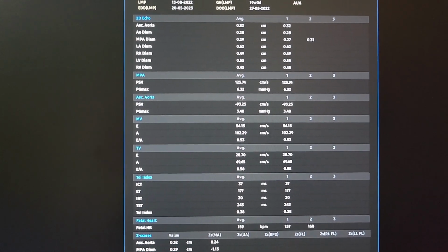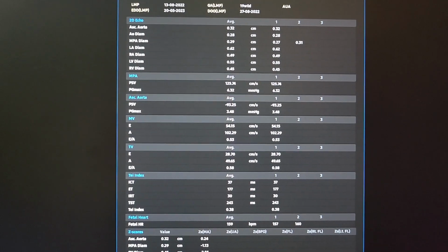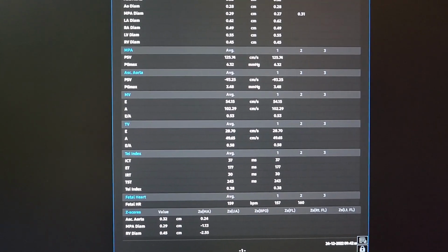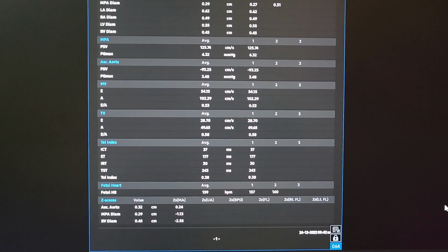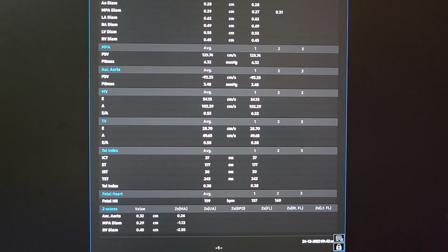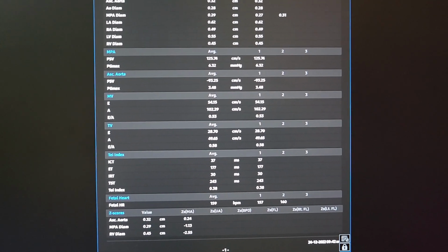The right ventricular hypoplasia is there, but the RV is kept open because of the flow across a large VSD from LV to RV. So this is a case of severe right ventricular hypoplasia with abnormal pulmonary valve, abnormal tricuspid valve, and probably secondary endomyocardial fibroelastosis of the RV.